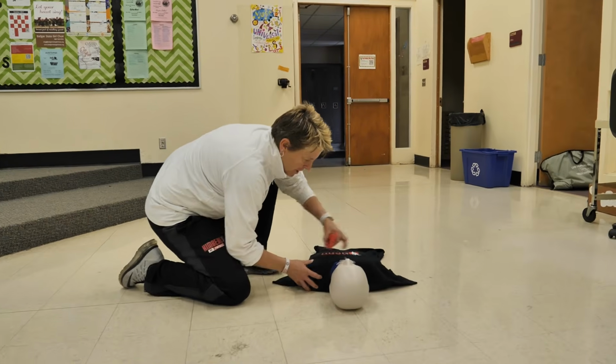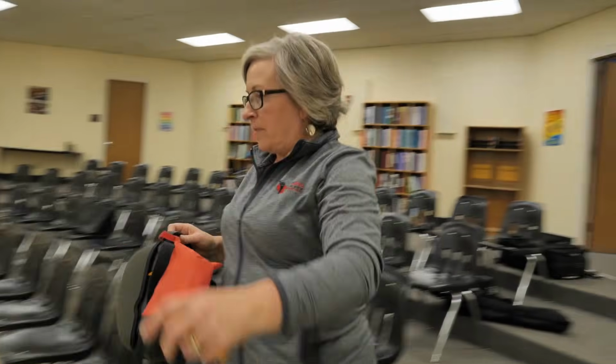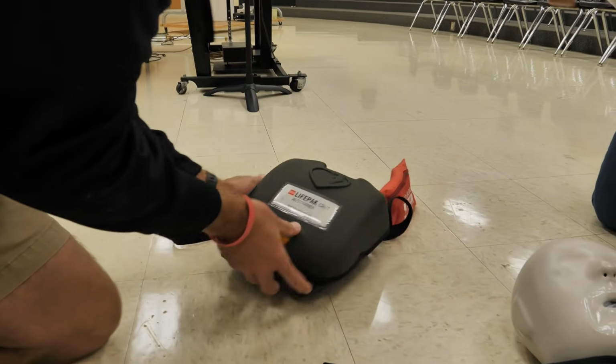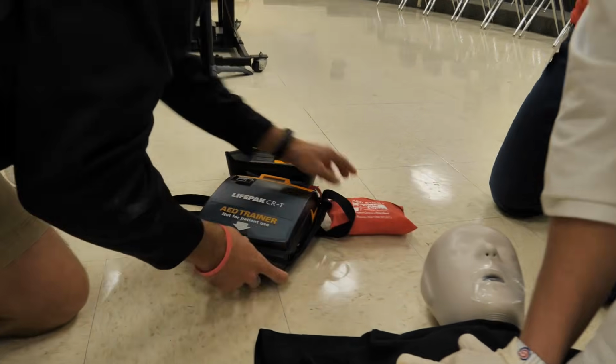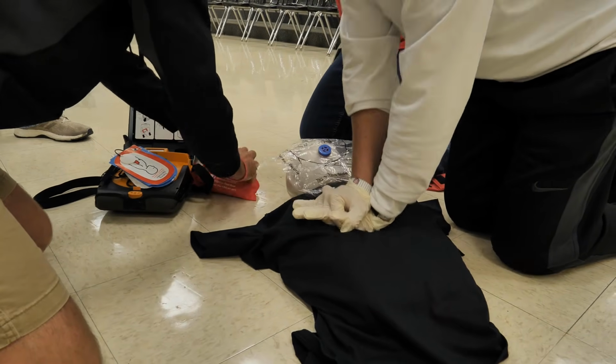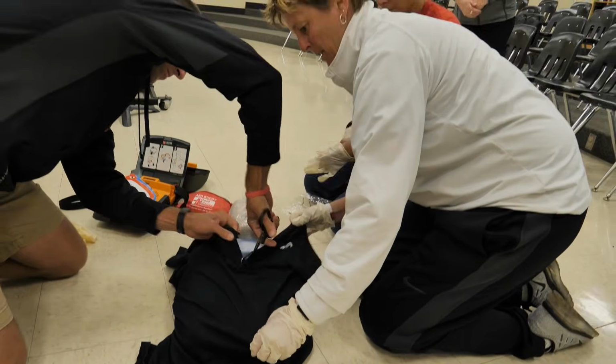Are you okay? Are you okay? Are there any signs of life? No signs of life. Begin compressions. Call for help now. 16, 17, 18. Remove all clothing from patient. Hey, Mary, I'm gonna cut the shirt.